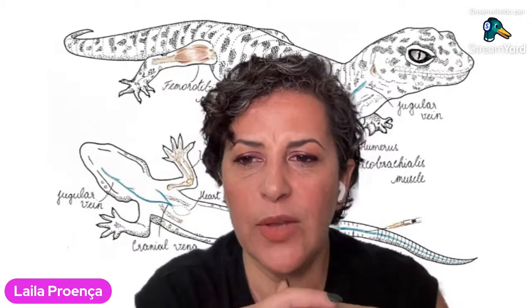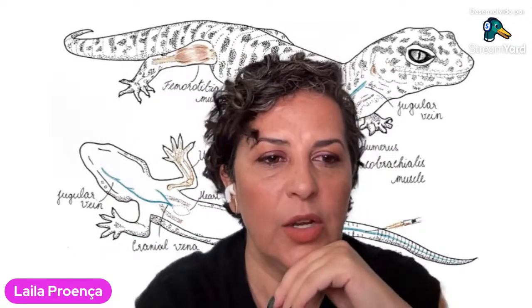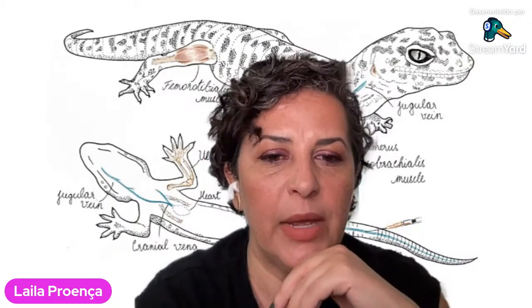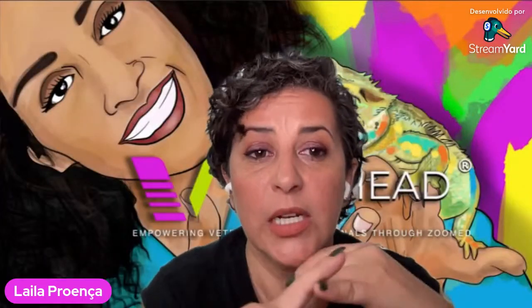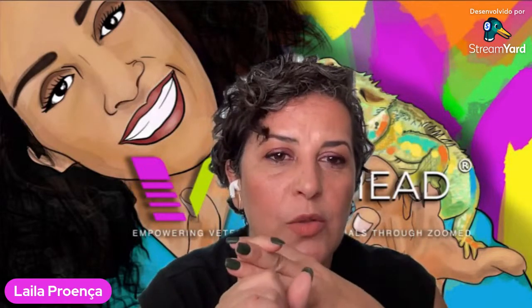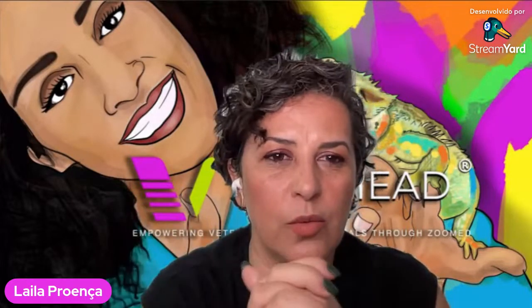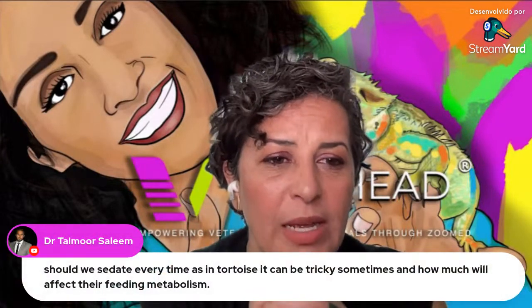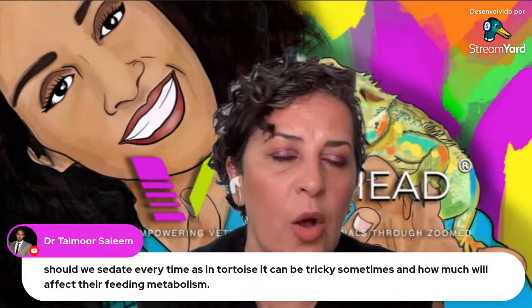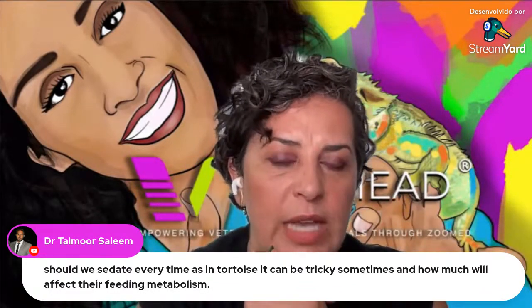Also, if you see ducks, I just remember that sometimes you might see ducks or chickens in some practices. And on those ducks, for example, also the cranes, the hornbills, and the crows, we need to use heparin. So if you see ducks, or hornbills, unless it's someone that has a collection at home, then again: hornbills, cranes, ducks, geese, swans, the whole Anatidae family, and the crows and ravens, we need to use heparin instead of EDTA for a CBC, okay?